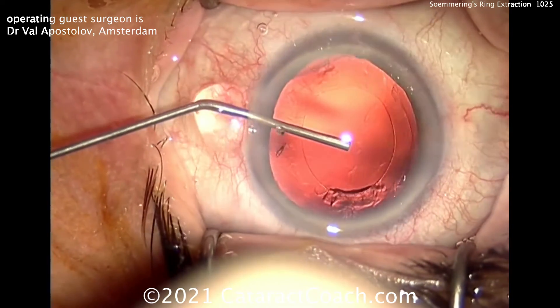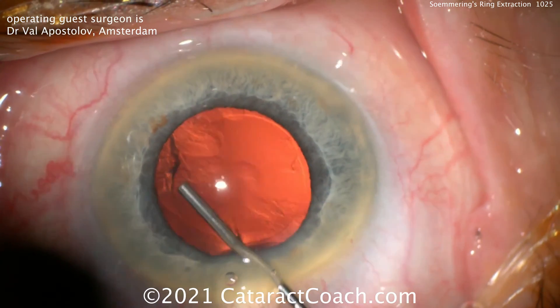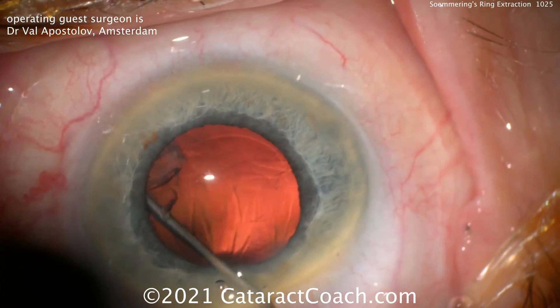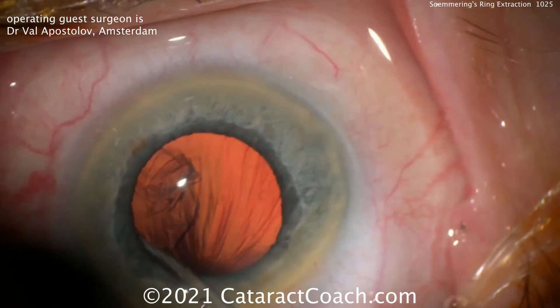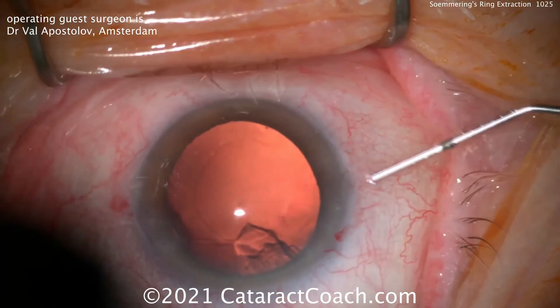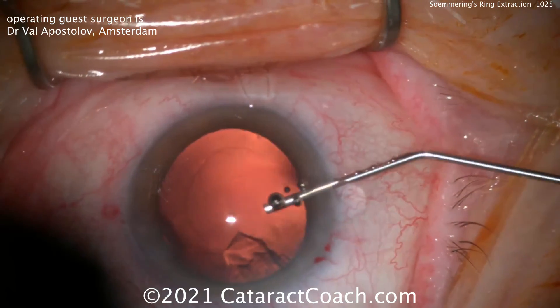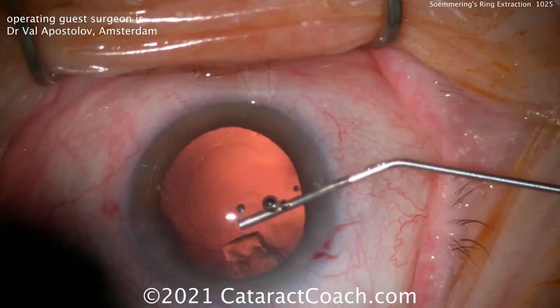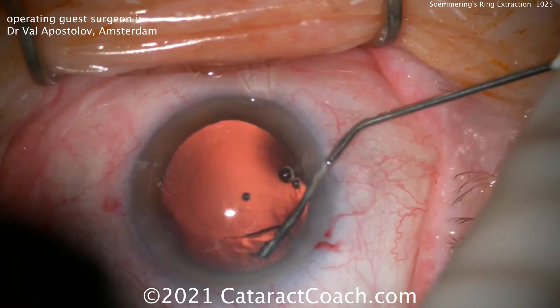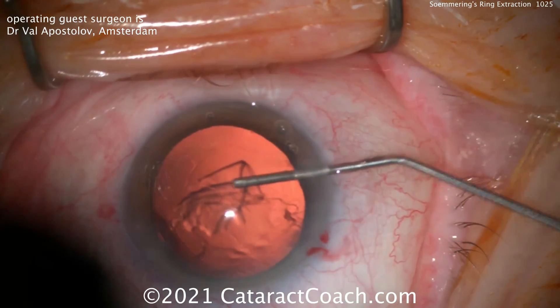There's another piece that was hidden — neat technique. Let's watch it again. The viscoelastic cannula is being used to inject OVD at the capsular bag equator, pushing that big piece of lens cortex forwards and out. There it goes — looks great. Here's the last video of that same thing. Thanks, Dr. Apostolov — always a pleasure to watch your videos. You're certainly an extremely talented surgeon. There goes the last bit of viscoelastic pushing out that last bit of cortex. Ready for the lens — case almost done.